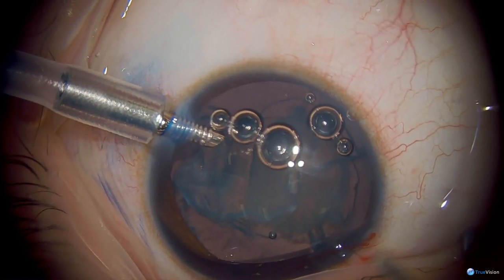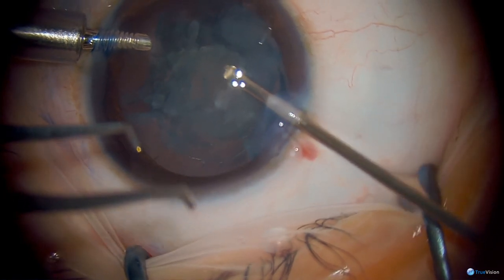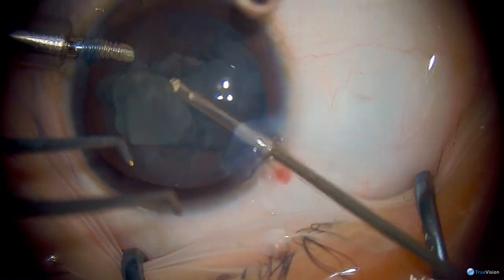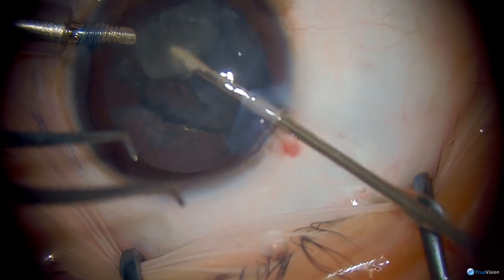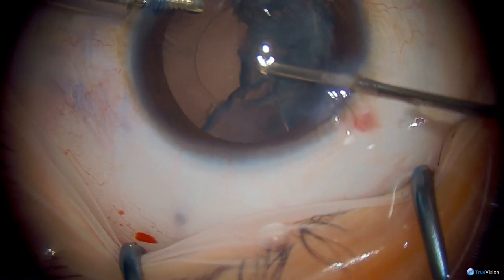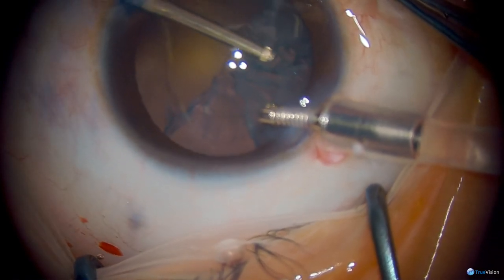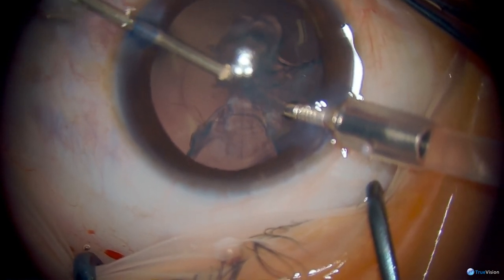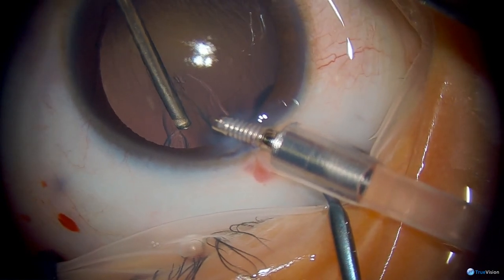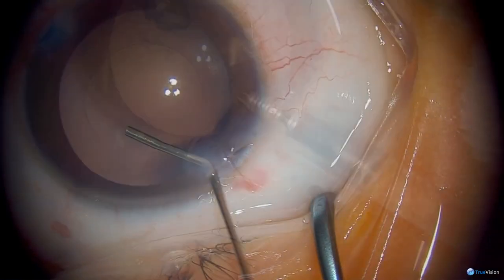Alternatively, if you have access to a small incision capsulorhexis forcep, you can do this through a simple MVR blade width incision and not have to place the suture in. I think that's ideal if that instrument is available to you. The vitrectomy handpiece is mostly being used with the port facing upward. The cortical material is relatively dense, so it does tend to follow itself out. An advantage of having two ports is you can use a bimanual technique, simply switching the anterior chamber maintainer and the vitrectomy handpiece to reach that very difficult sub-incisional cortex, which is quite easy when you go to a port 90 degrees or more opposite your primary incision. And the last little bit of cortex has come out there.